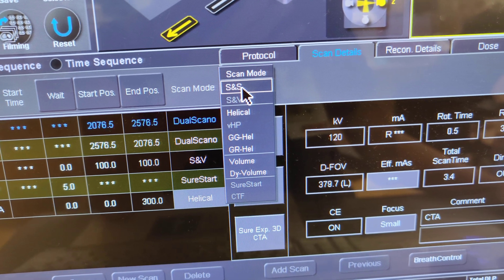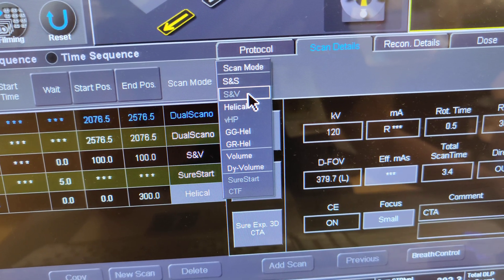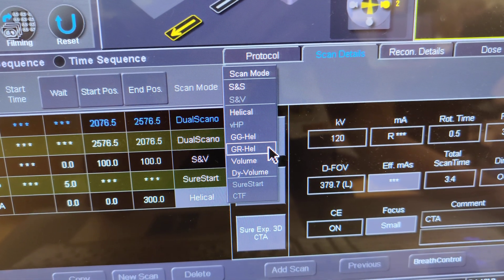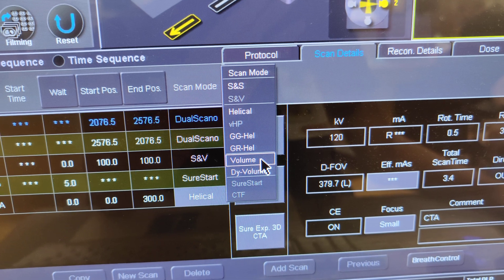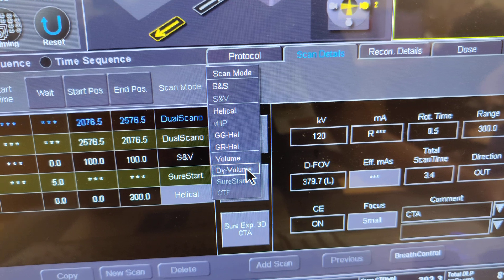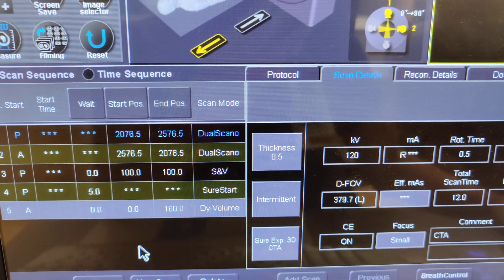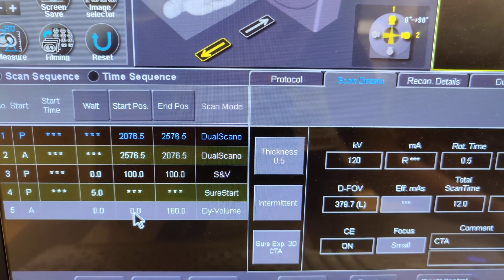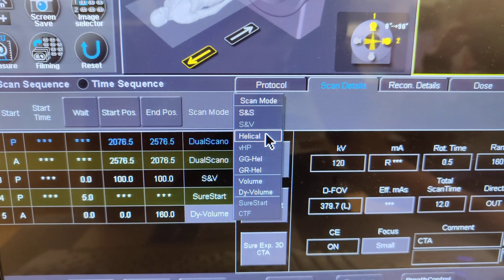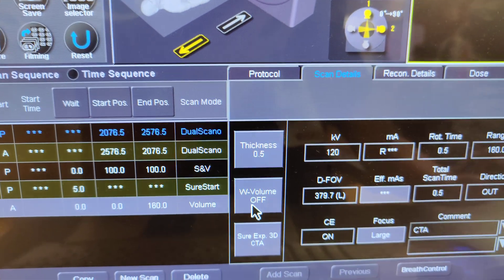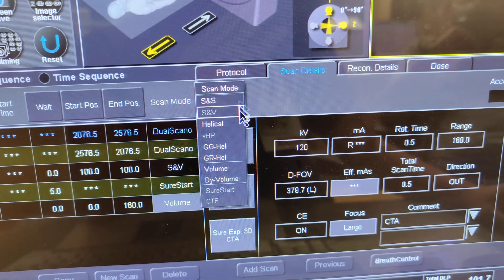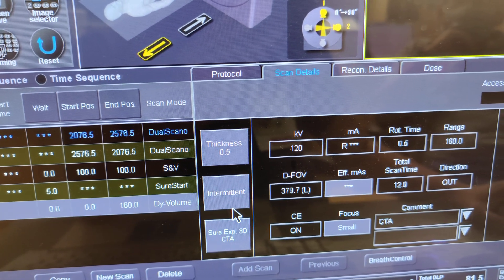To summarize the scan types: SNV is scan and view, helical is spiral, GG is go-go, GR is go-reverse, and volume is the standard volume scan. There's also DY volume — dynamic volume — which appears to be for lungs, though I'm not entirely sure. Wide volume with dynamic settings gives an intermittent acquisition mode.